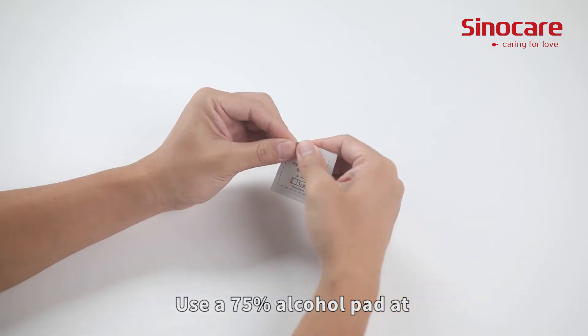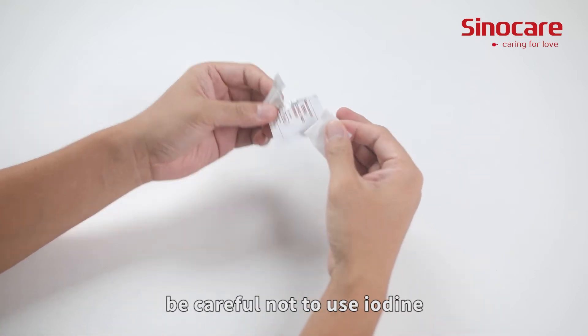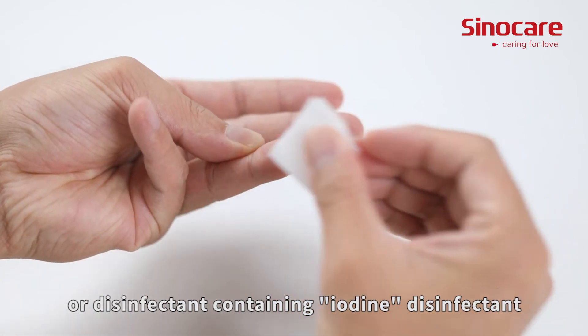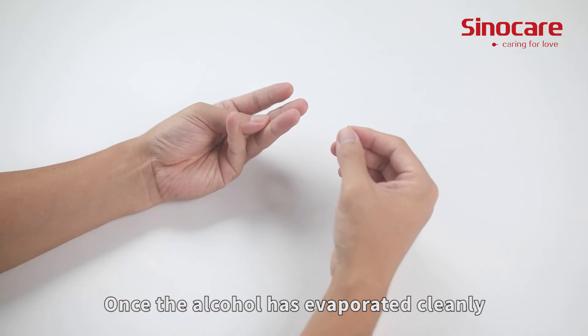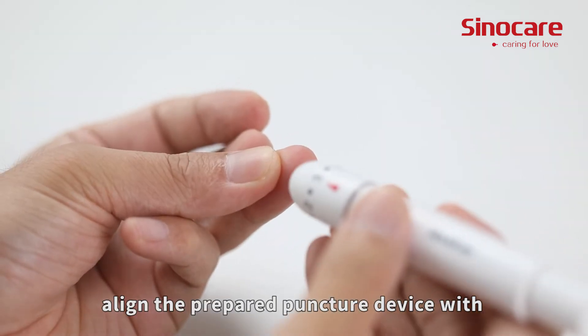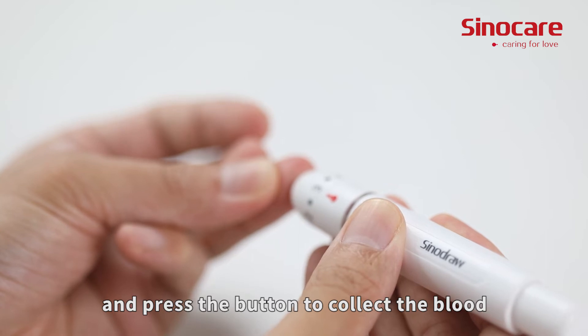Use a 75% alcohol pad at the blood sample site for disinfection. Be careful not to use iodine or disinfectant containing iodine. Once the alcohol has evaporated cleanly, align the prepared puncture device with the disinfected skin and press the button to collect the blood.